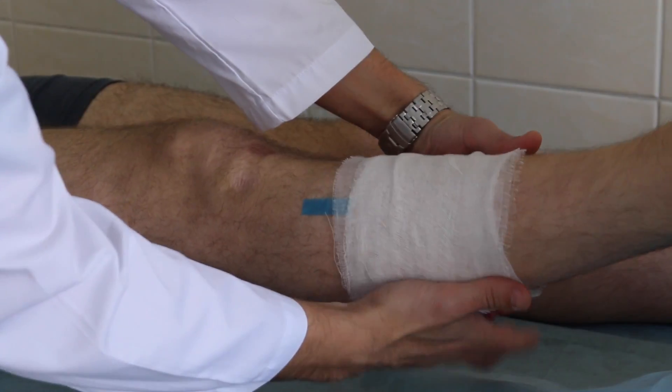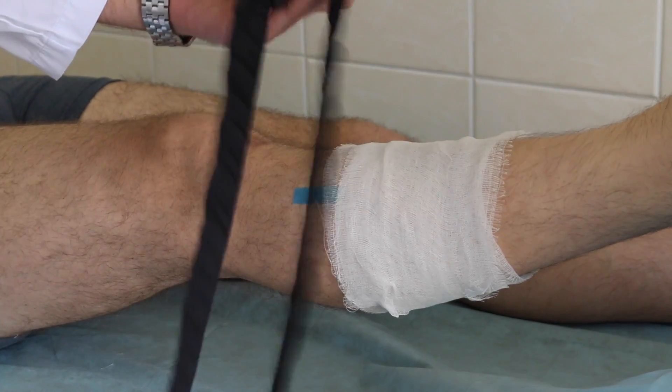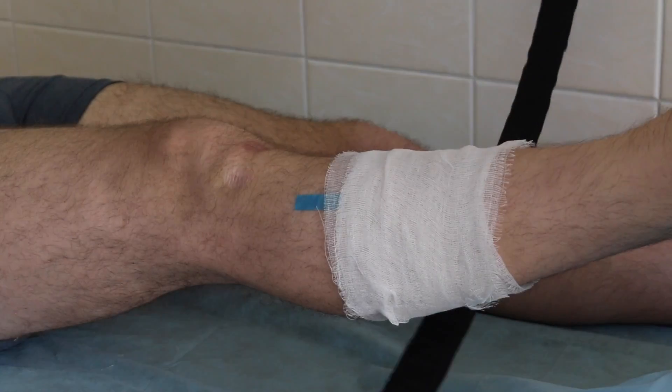Tourniquet application is temporary and short-term only. As a general guideline, 2 hours is considered the maximum length of time a tourniquet can be applied before neuromuscular injury begins.